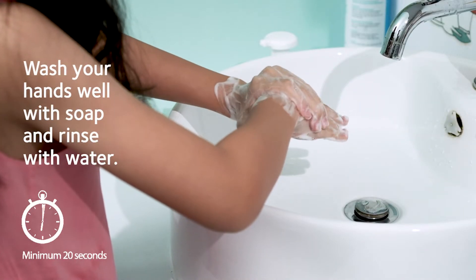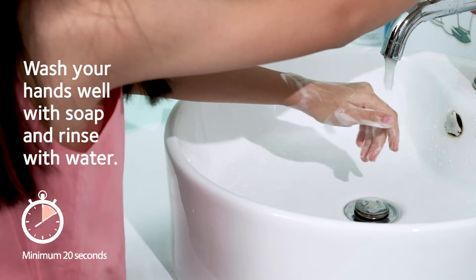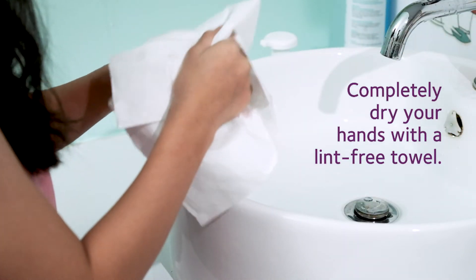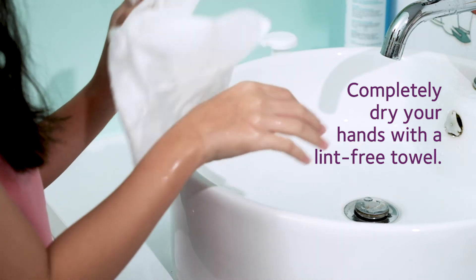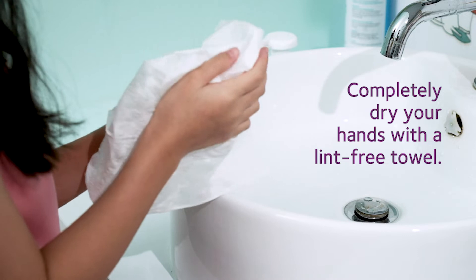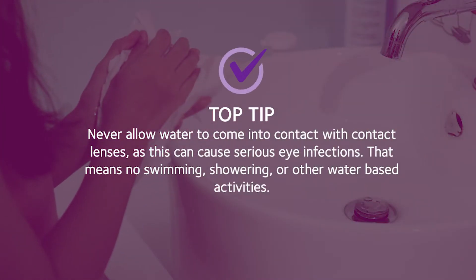Wash your hands well with the soap and rinse carefully with water. Now completely dry your hands with the towel. It's really important you dry your hands properly, because water should never come into contact with your contact lenses.